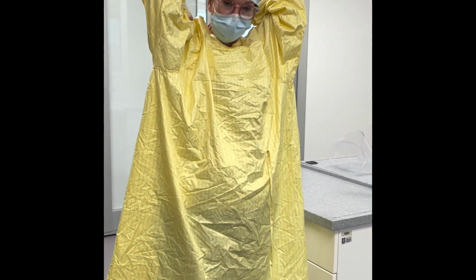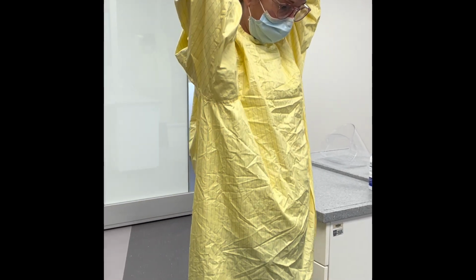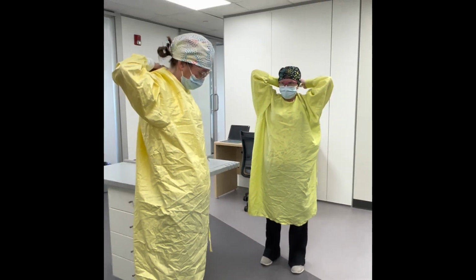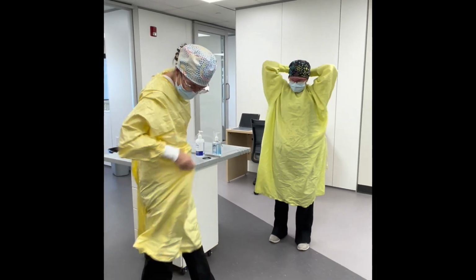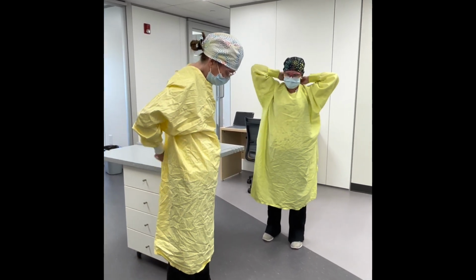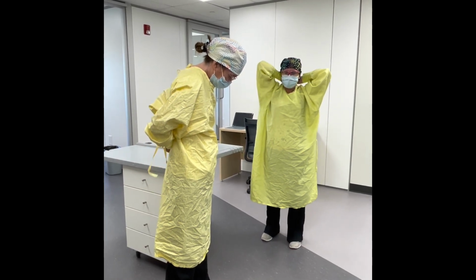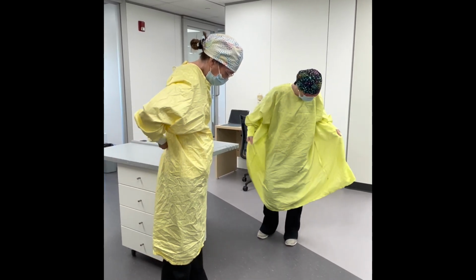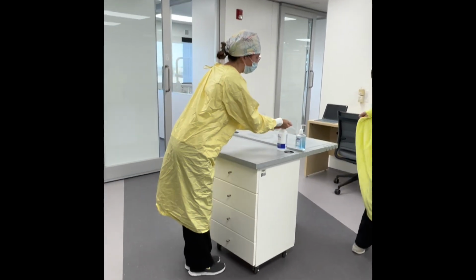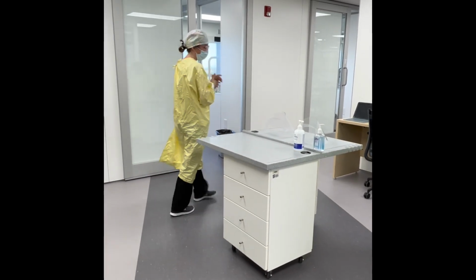These gowns, you'll get used to putting them on, but some of them have ties that are in different spaces than the other ones. For the purposes of this course, we will not have you full gowning for the beginning. We will start gowning closer towards the end for practice purposes. We're just trying to save gowns, but right now we will do it just for the sake of our video because we will be doing this during the procedure. Because I've just touched the back of my neck, I'm going to do a gel. And next what I would do is I would put on my shield.